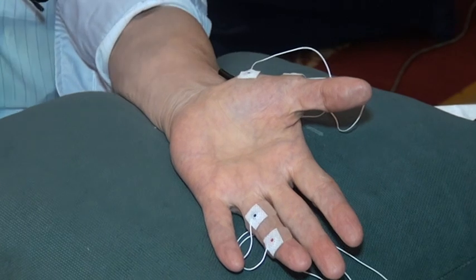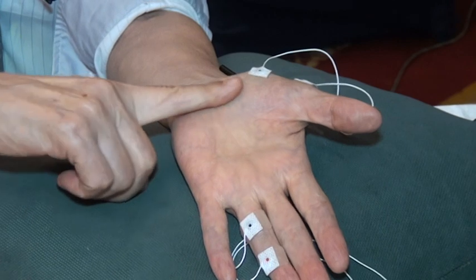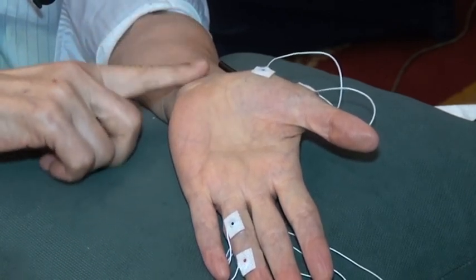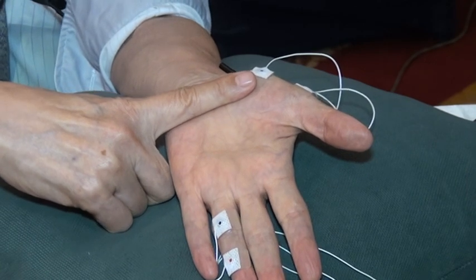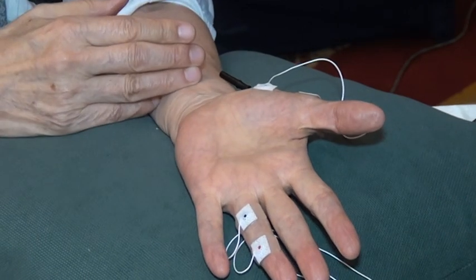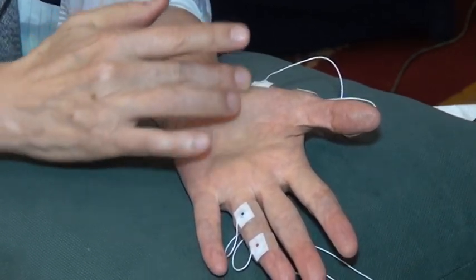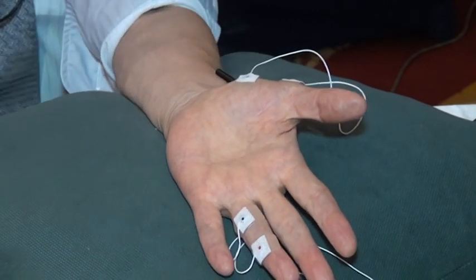And when I say distal, it is distal to the site of the lesion. And in carpal tunnel syndrome, which is the most common mononeuropathy, compression is here. Compression is not at the wrist. Compression is in the palm. And therefore, when you stimulate at the wrist, that's a proximal stimulation to me. And the proximal stimulation doesn't help you. You have to stimulate distal to the site of the lesion. Is that all right? That's what I'm going to show you.